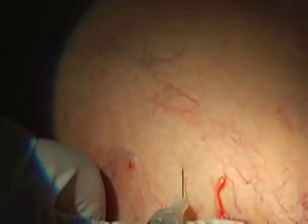And the glycerin is another sclerosing agent. I like to use it for the spider veins because it's less painful and we have fewer side effects, in that we don't have skin discoloration, we don't have matting, and all the problems that are usually associated with sclerotherapy are virtually eliminated with this glycerin solution.